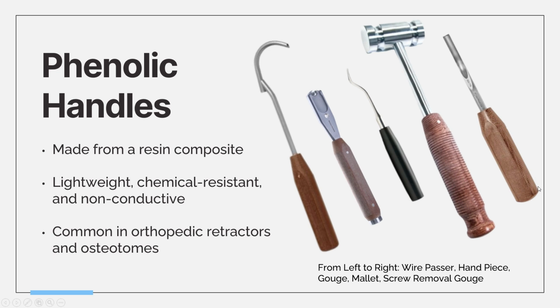So let's say a patient came in beforehand and received an orthopedic surgery. Let's say they were implanted a metal plate, and eventually they will heal, and so the surgeons will have to go back in to remove that plate since it's no longer needed. It was only temporary, and this part will remove the screw more easily.